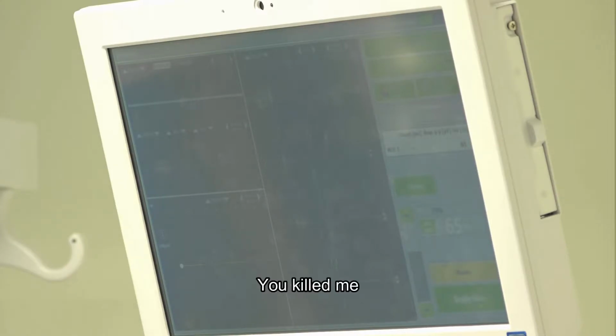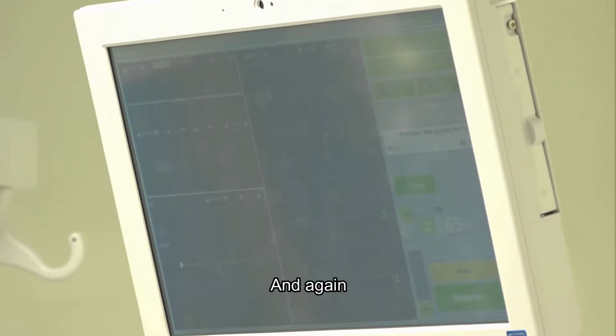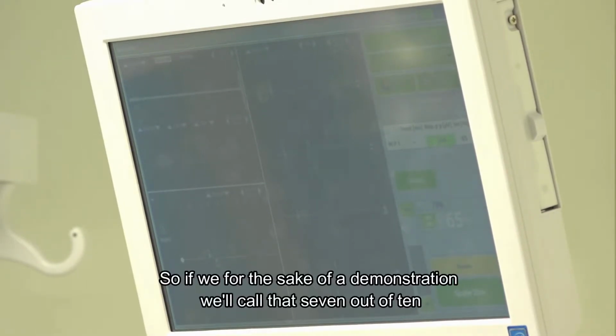Oops. You killed me. Okay, keep going. There's 5 out of 10. Keep going. And again. And again. Okay. So for the sake of a demonstration, we'll call that 7 out of 10.